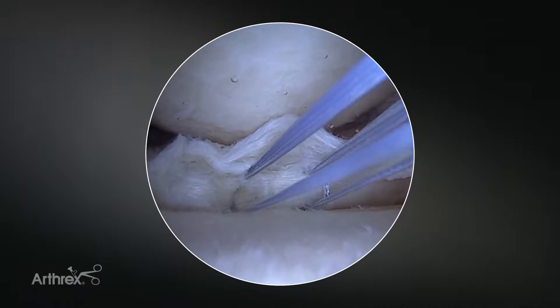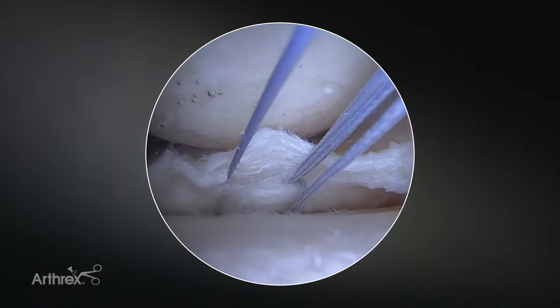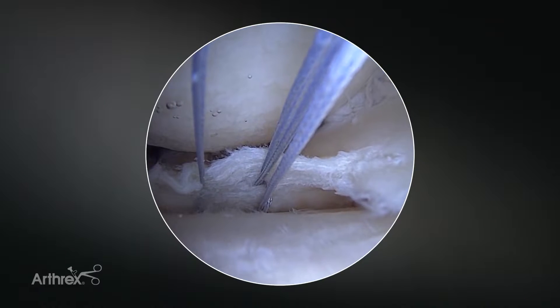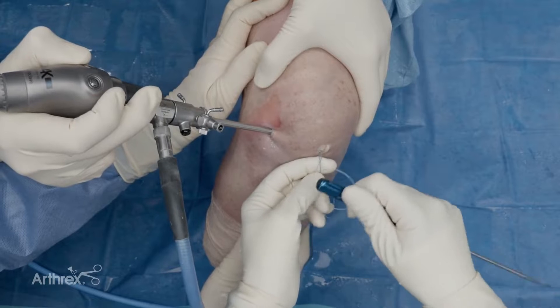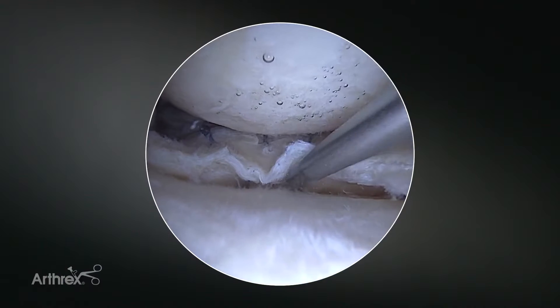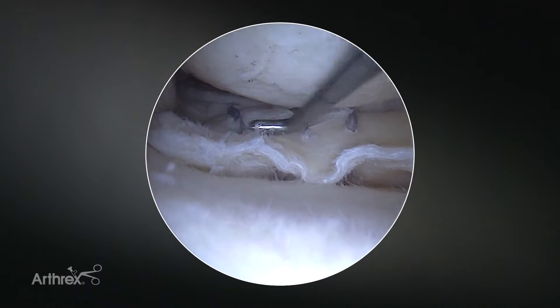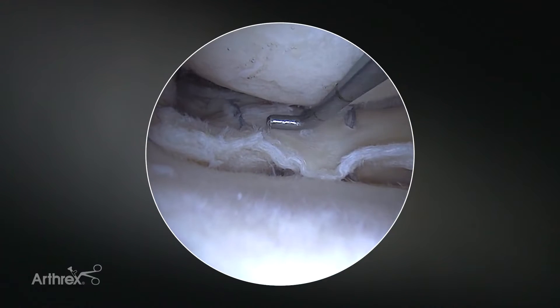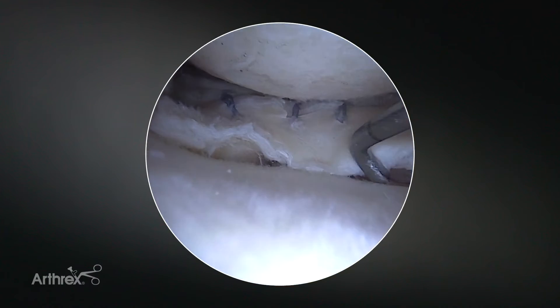As we tension the tibial side sutures down, it does tend to take away that eversion of the meniscus. Having placed both of your implants on the tibial side first prior to tensioning really helps you ensure that you have perfectly placed vertical mattress stitches. That's our second implant. We come in here and cut our final suture. This is the final repair — you can see we have three vertical mattress stitches across the femoral side and two across the tibial side, anatomically reducing the medial meniscal tear and giving multiple points of excellent fixation and compression across the tear site to ensure healing and excellent initial strength with loading and weight bearing.